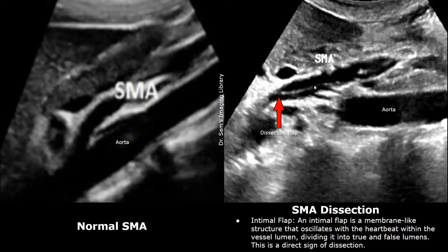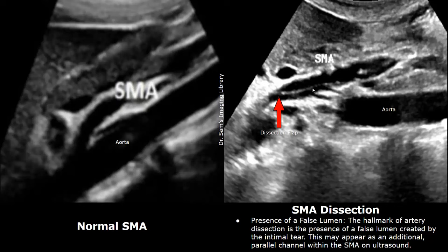The intimal flap will oscillate with the heartbeat within the vessel lumen. There will be a true lumen and a false lumen — the area below the intimal flap is the false lumen, while the main lumen of the artery is the true lumen. This is a direct sign of dissection. The combination of an intimal flap and a false lumen is a strong sign of arterial dissection.